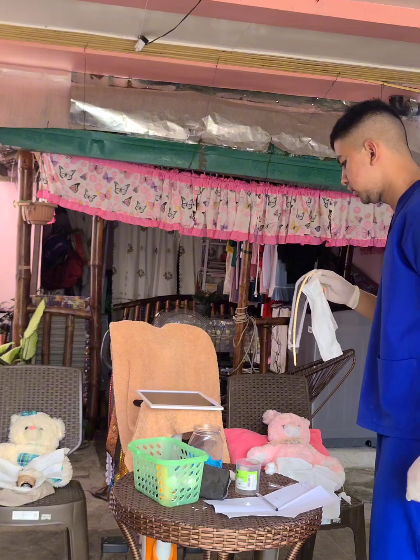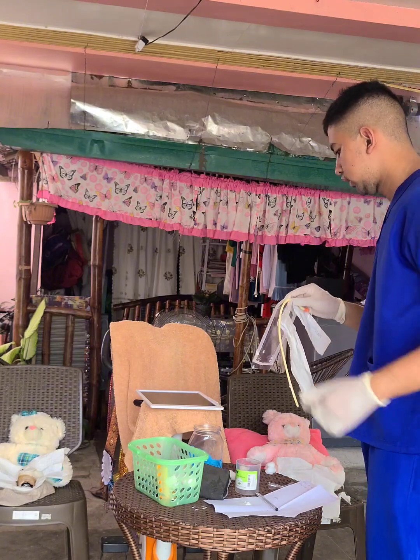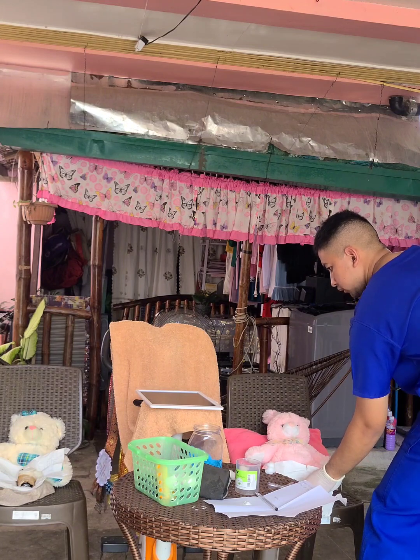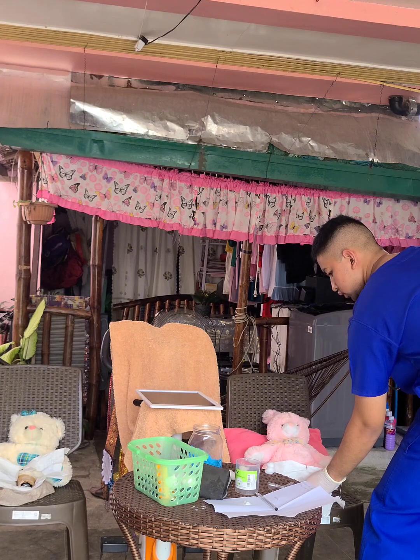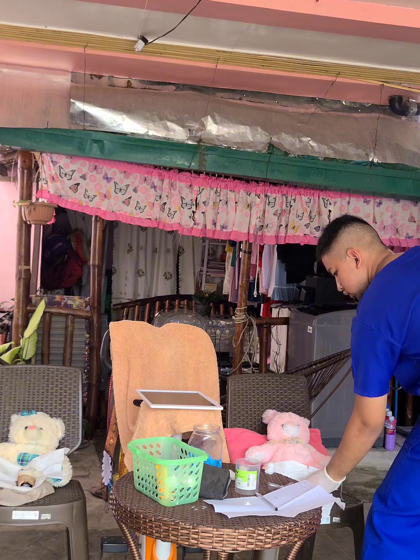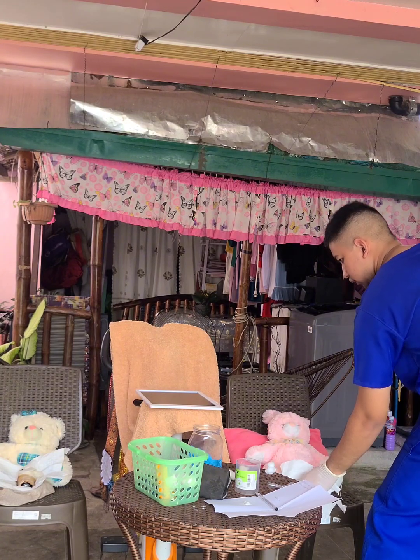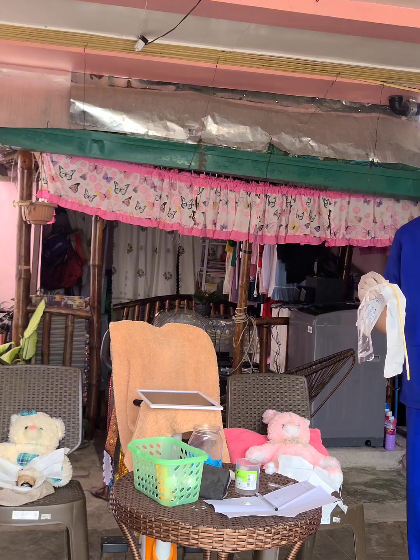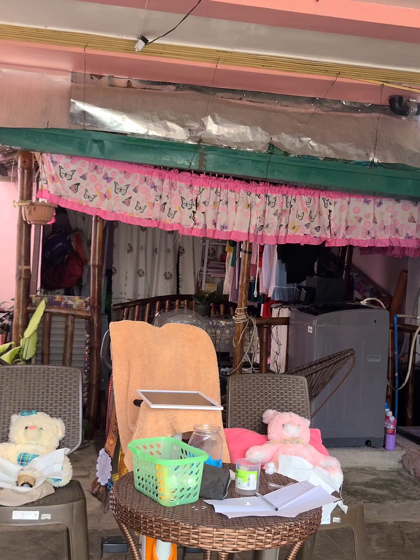Then here we're going to, with the gloved hand, spread the labia. There we assess how far to insert the catheter.